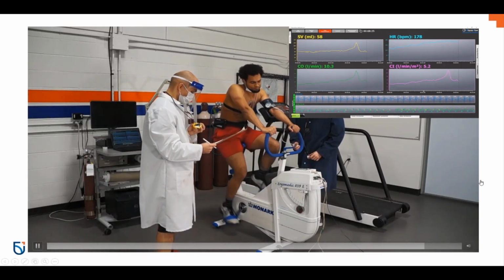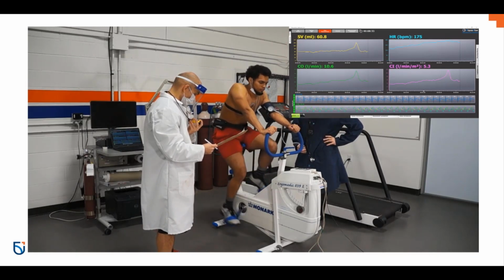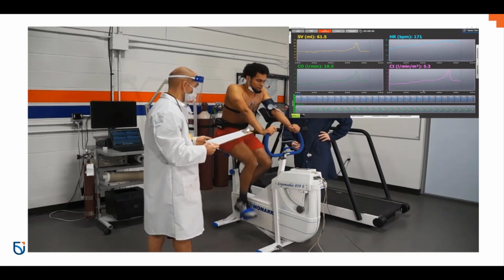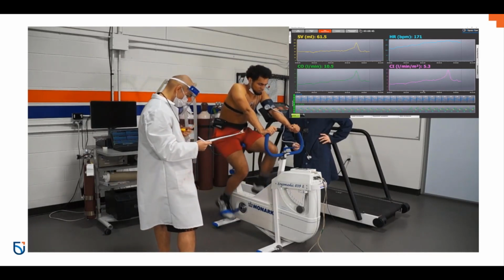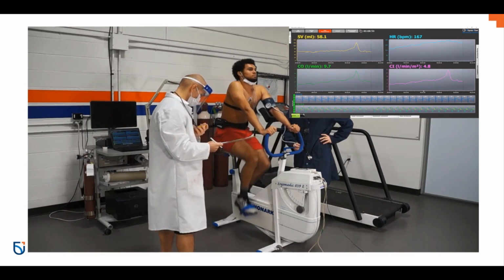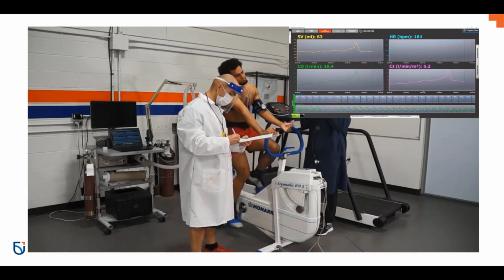And you'll see that very often on cycle tests, a lot less on treadmill tests. On a treadmill the person will tire out more as a whole body. But on cycling, the person with pulmonary, like breathing wise, feels okay, whole body RPE feels okay, their legs are a 25 out of 20, I have to stop. And they almost are frustrated as well because they're just going, it's my legs. And then after the fact, they know that they probably could have gone longer, but that's just the fact that they're not cycling, and you get up to those high wattages very quickly, which really burns the person out.